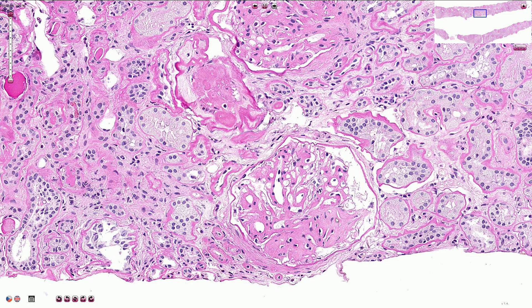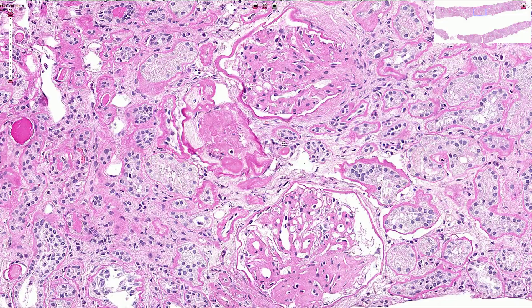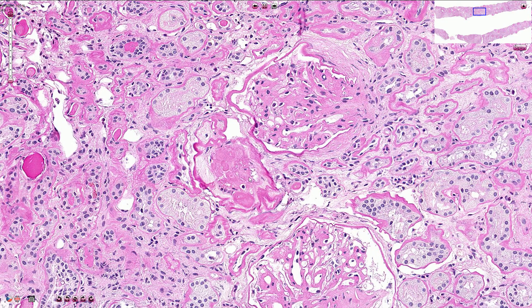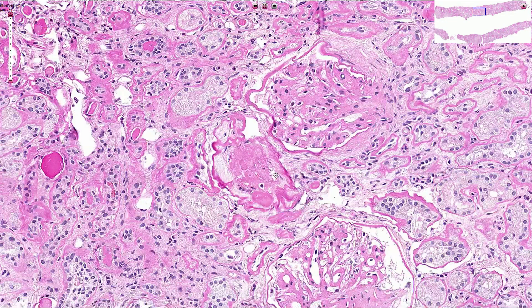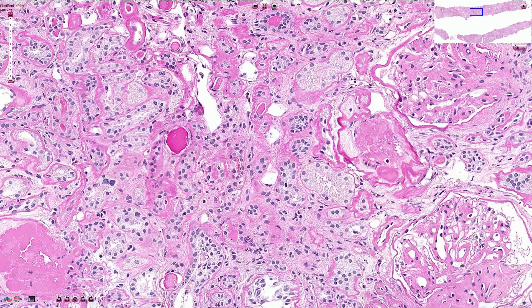This mesangial sclerosis can then progress into a nodular phase and create nodules. When we see these nodules we call that Kimmelstiel-Wilson syndrome, and these nodules are also called Kimmelstiel-Wilson nodules. Here we have an example of the nodular structure.